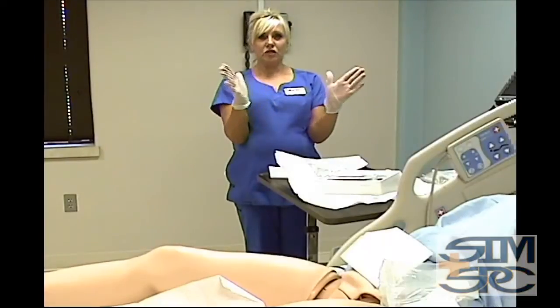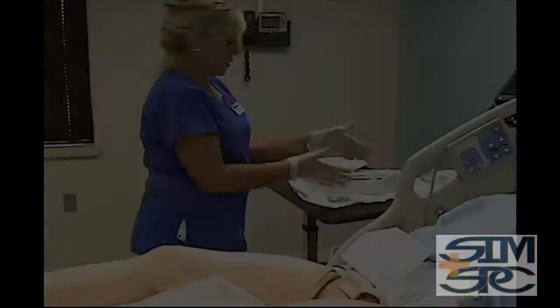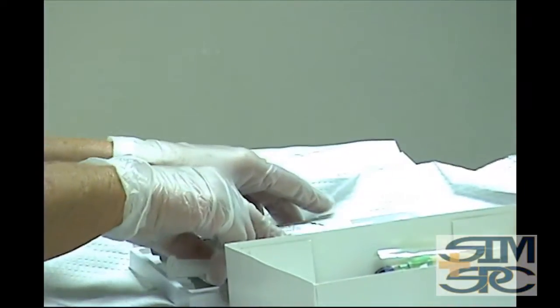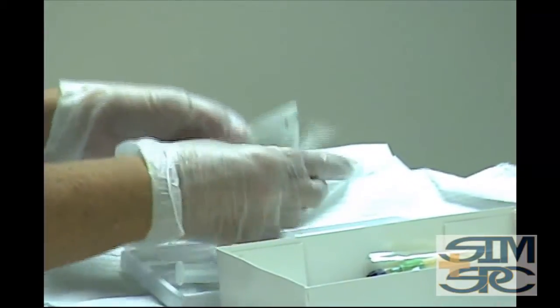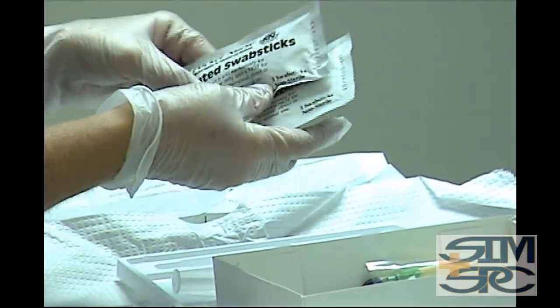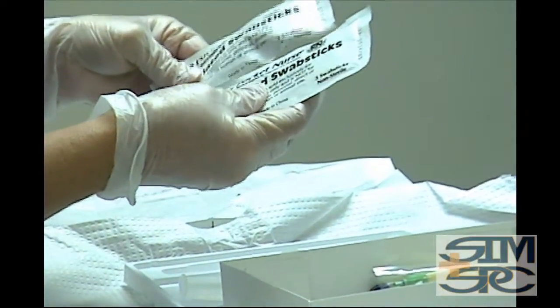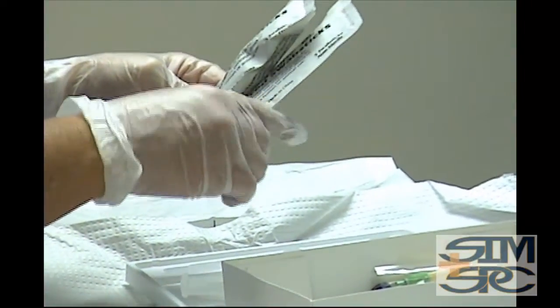Okay, and once the gloves are on, now you're ready to get into your sterile field. Once you remove the cover, you've got to stay within your 1-inch border. And here's your saline that you will check your balloon inflation with. And here are your two sets of swabs that you can use to clean with. Since you have two sets of swabs, if you've got three to a package, you can clean the labia majora and the labia minora, on both sides.